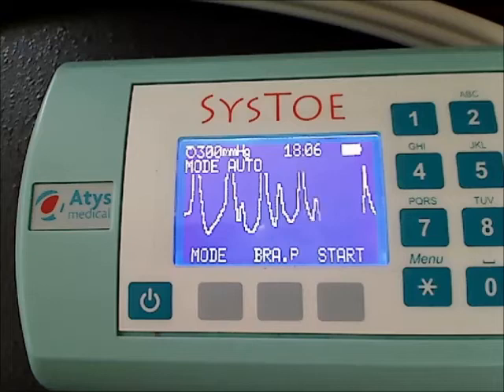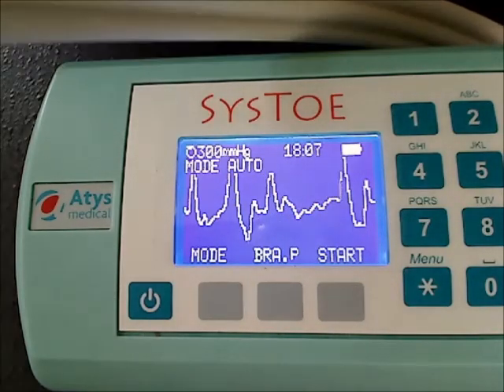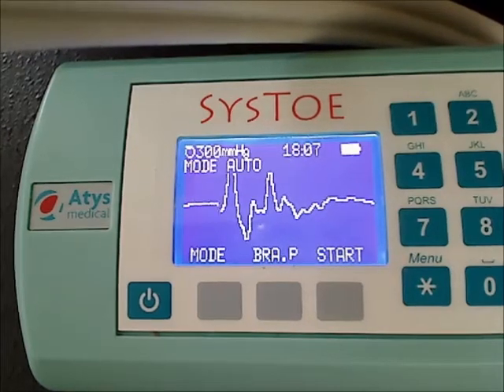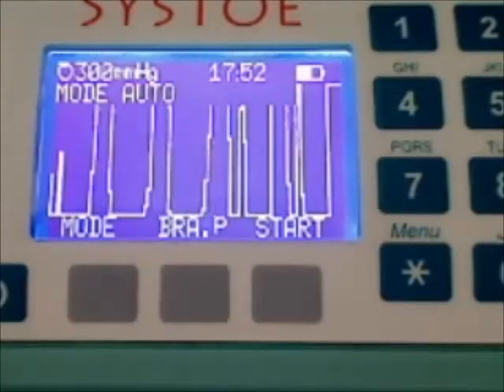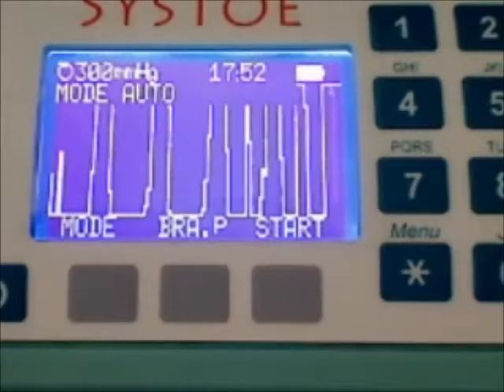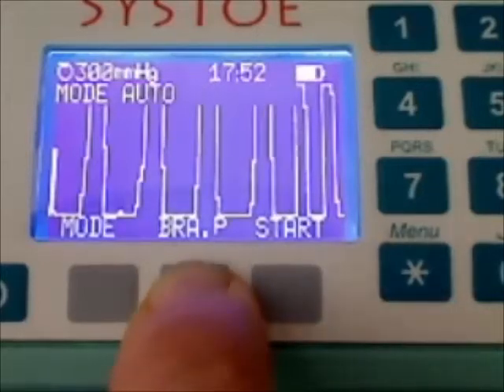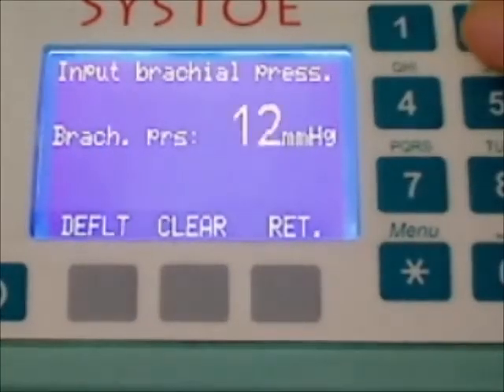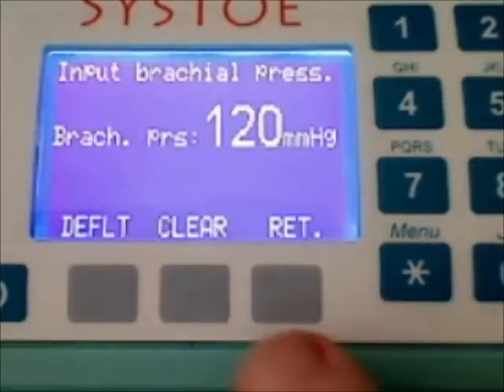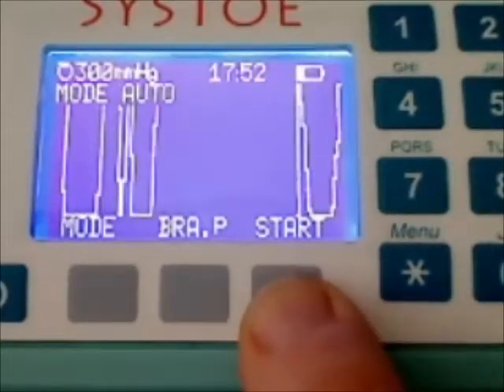The initial signal can be pulsed, as it is the case here, or it can be completely flat — it doesn't matter. Before doing a measurement, it is possible to input the patient's arm pressure. To do that, click on the brachial pressure key. Let's consider a pressure of 120 and click on Return. Now let's start the measurement by clicking on Start.